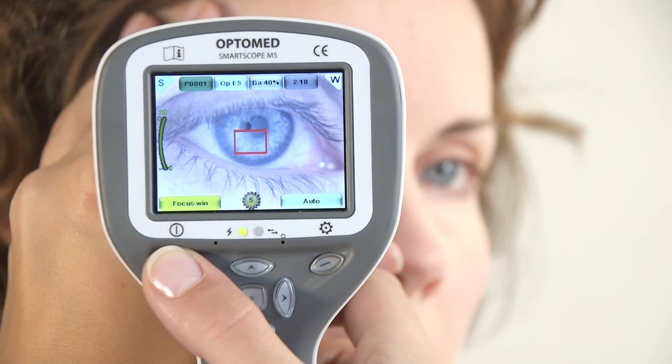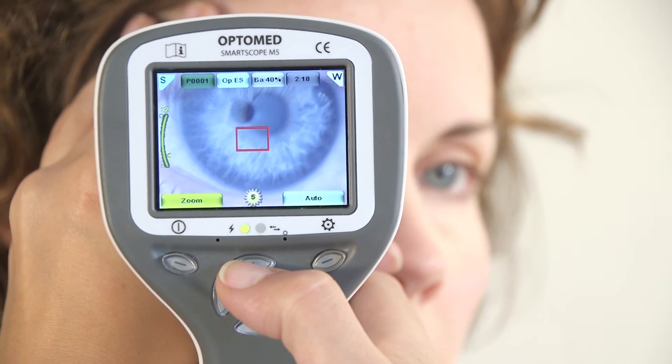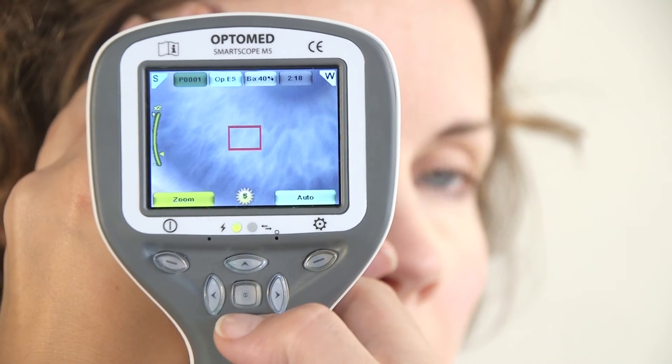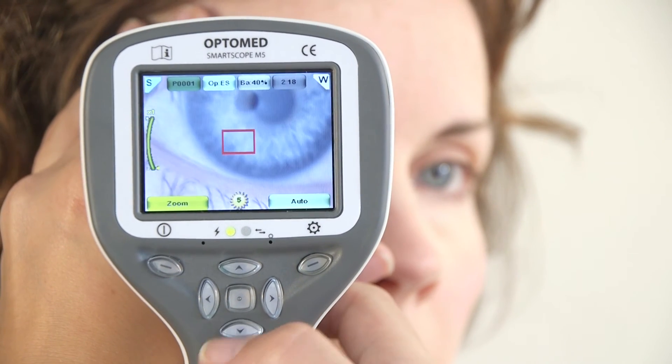If needed, activate zoom by pressing the left soft key. There are four zoom levels: 1, 2, 4, and 6. You can zoom in and out by pressing the up and down arrow keys.